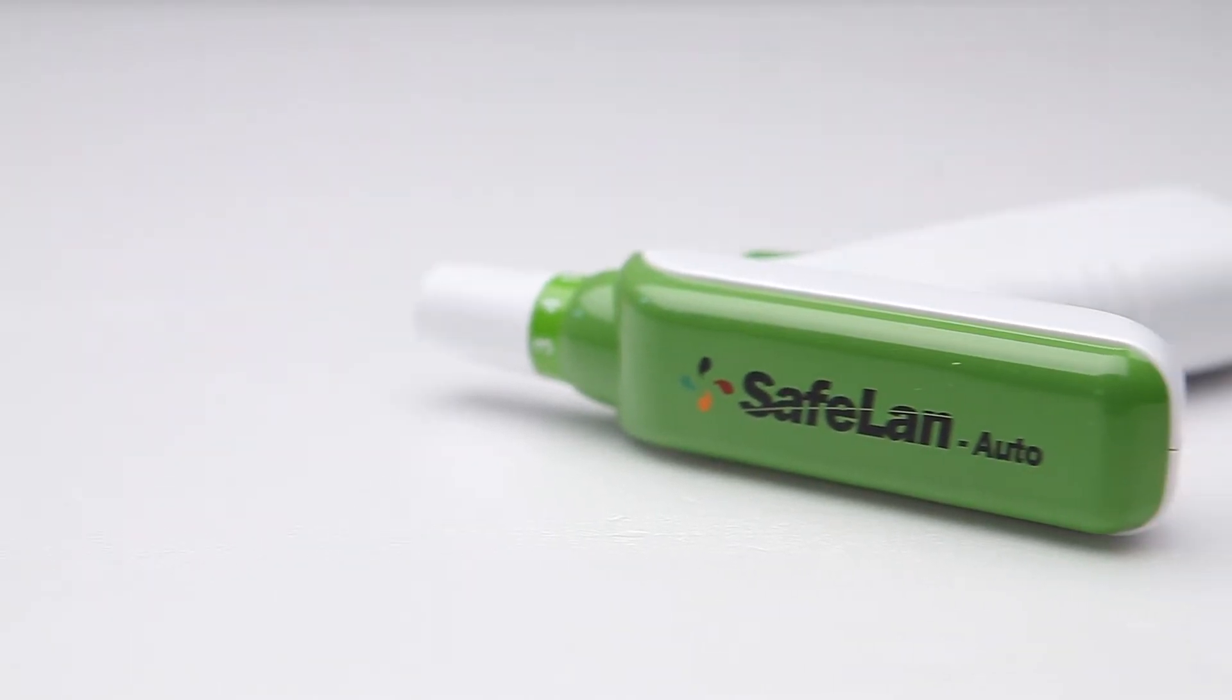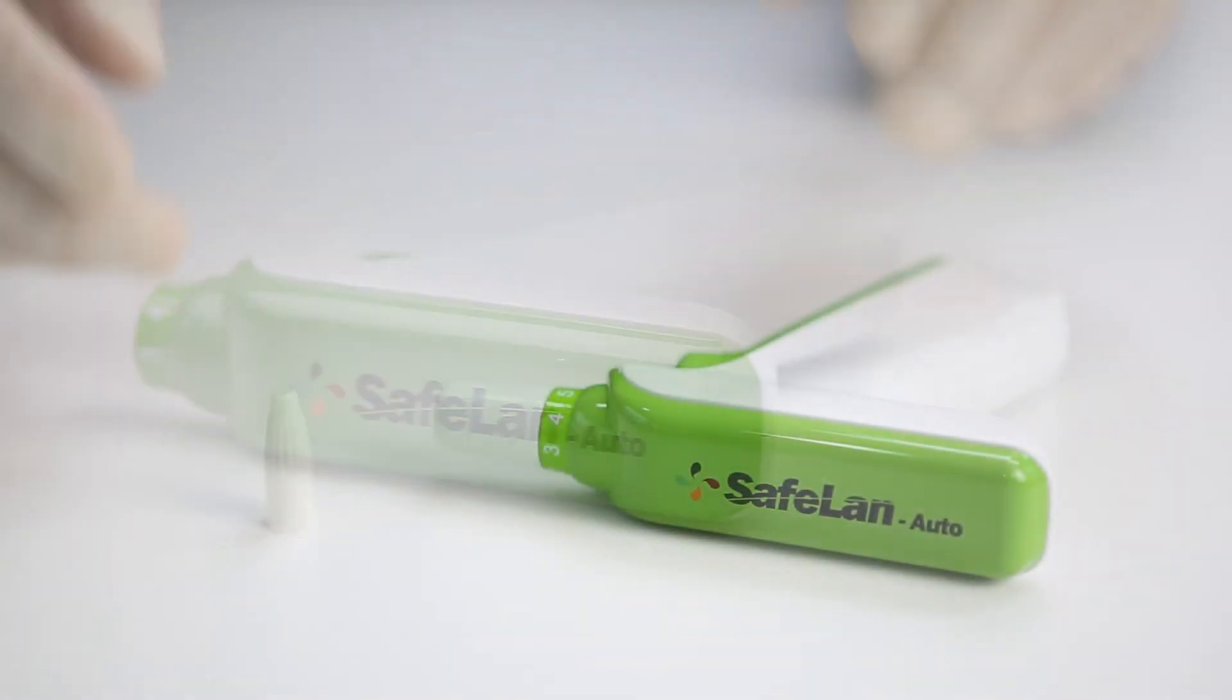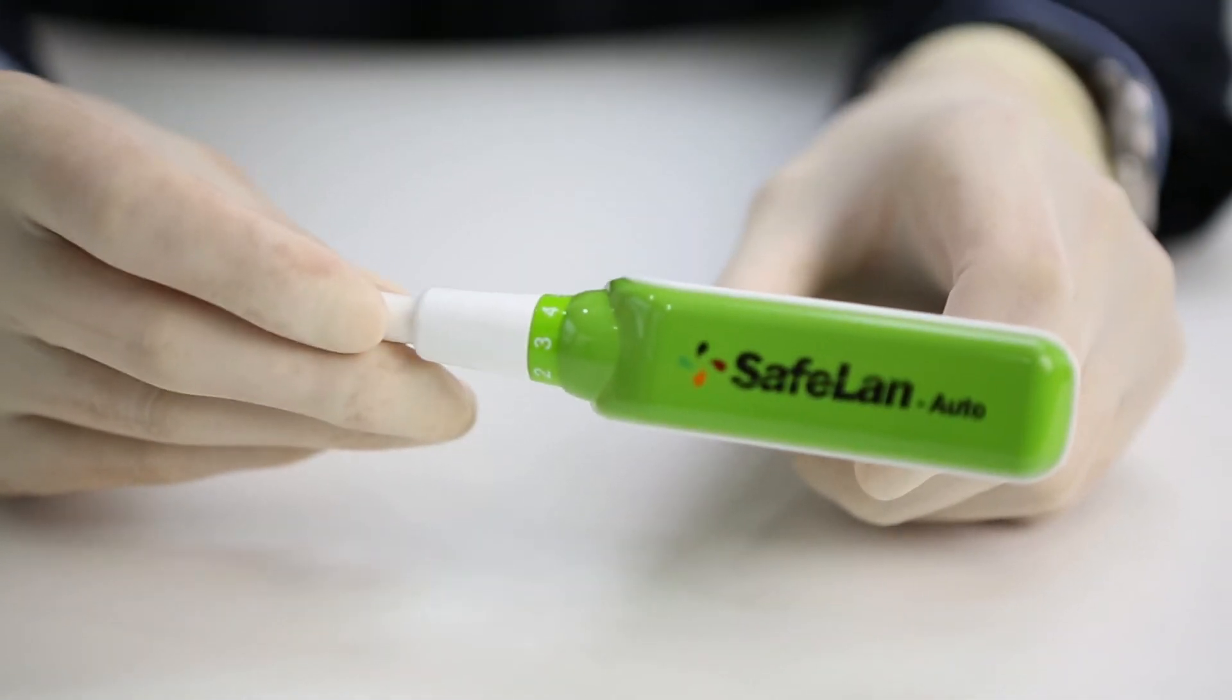SafeLan Auto, which uses SafeLan 26G, is a product used for bloodletting, similar to bloodletting moxibustion treatment.